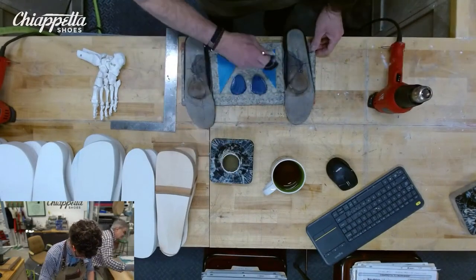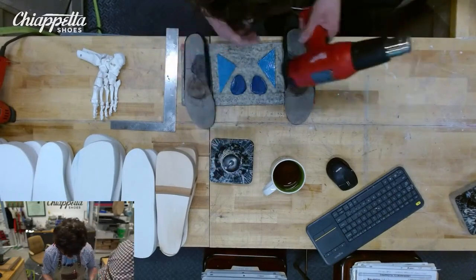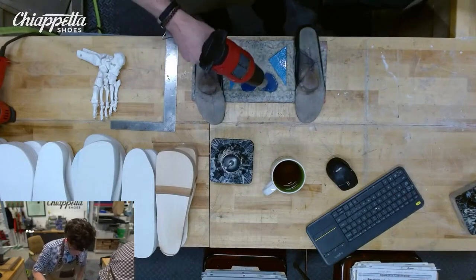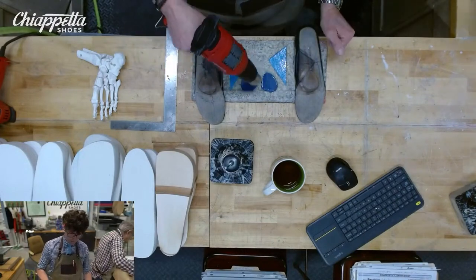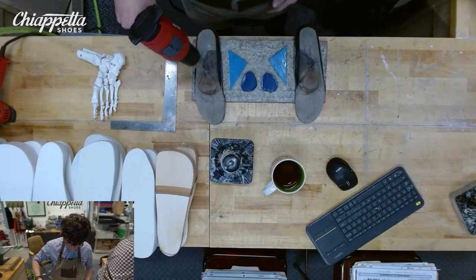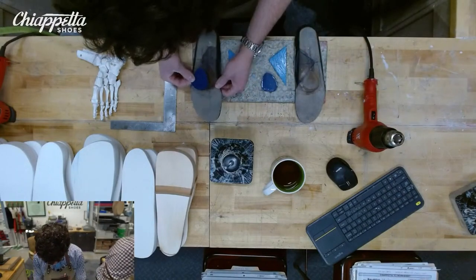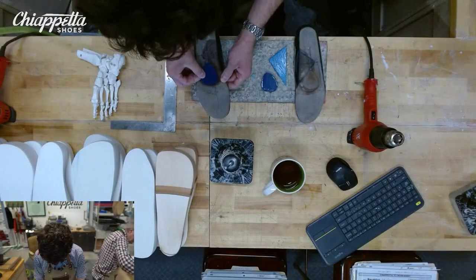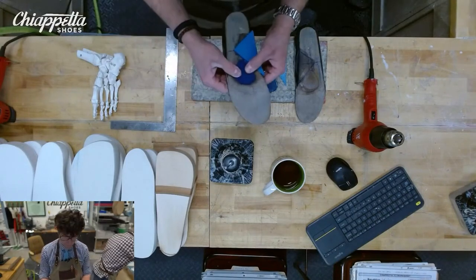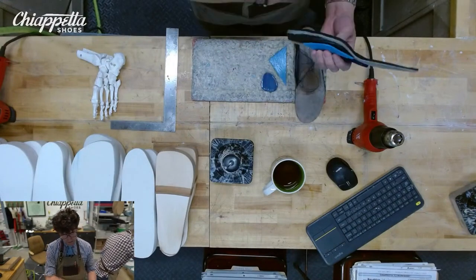of the midfoot, looking at the medial arch, trying to build that up a little bit. So with this modification, this customer is getting 2 new sets of orthotics. Takes us 2 weeks to make a new set. Now when we're doing a new set, we're doing a modification here. When this customer comes to pick up this new set of orthotics, we'll have enough time to say, hey, this has worked out pretty well. Let's do the same thing on the new set, or maybe we need to switch things up a little bit.